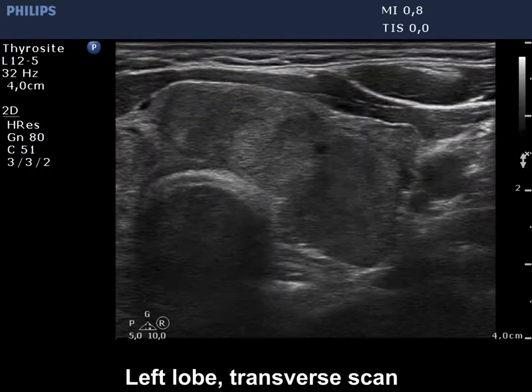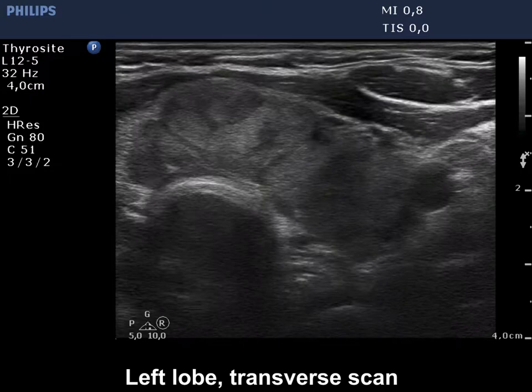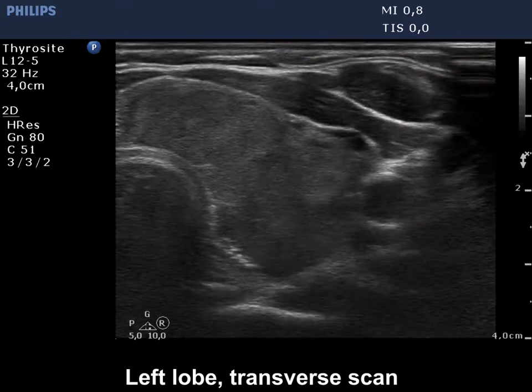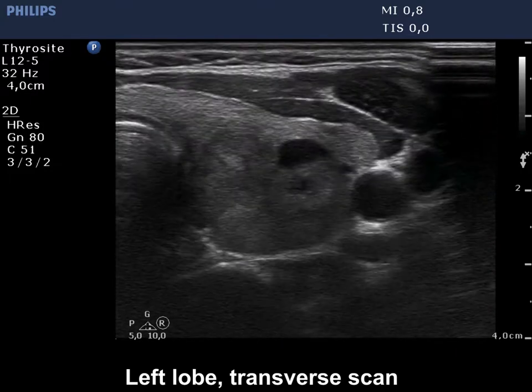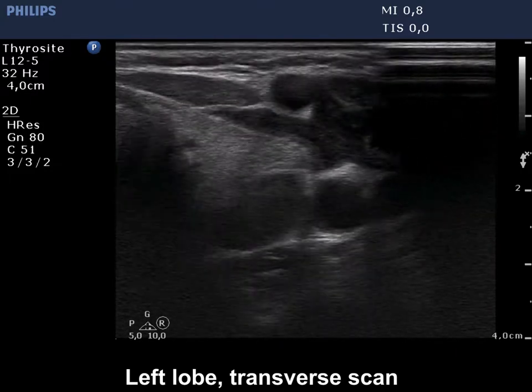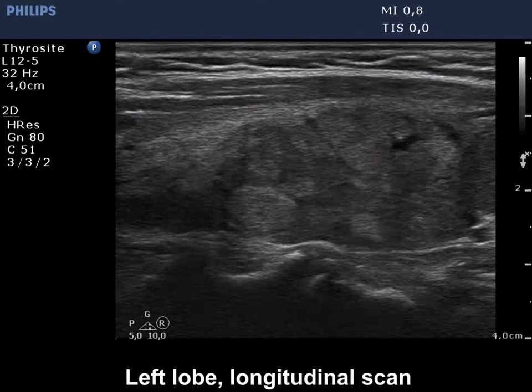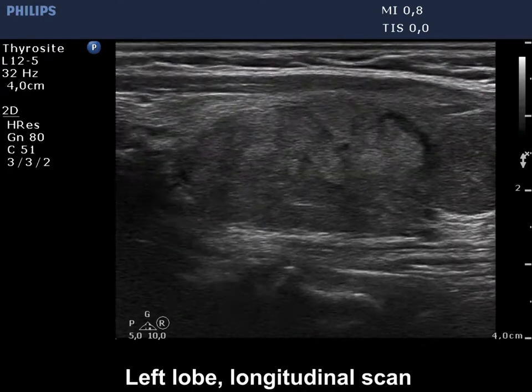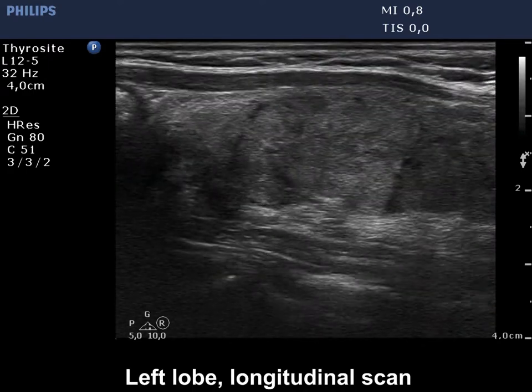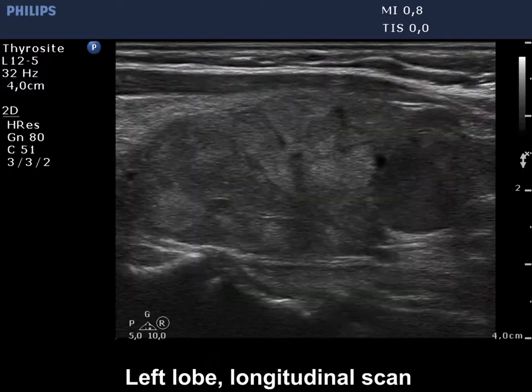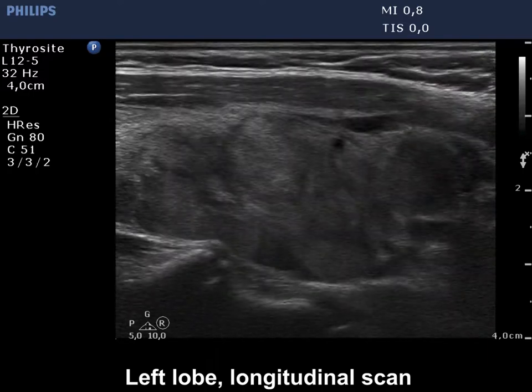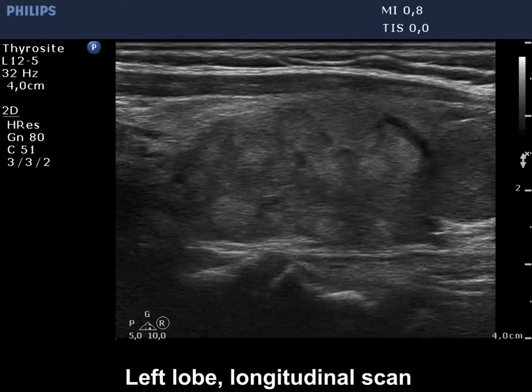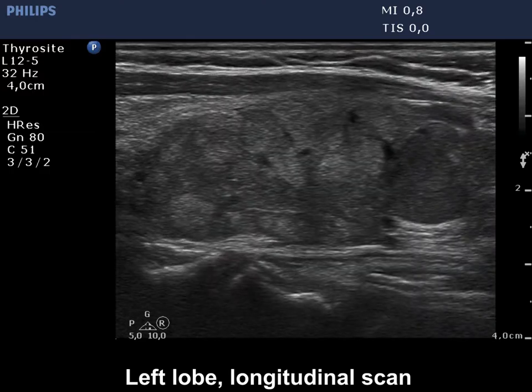The discrete areas correspond to pseudonodules or pseudolobes — this is the micronodular form of Hashimoto's thyroiditis. The complex mass has an undulated surface, like a bunch of grapes. This appearance is caused by the presence of multiple smaller lesions next to each other, and is a non-pathological lobulation.